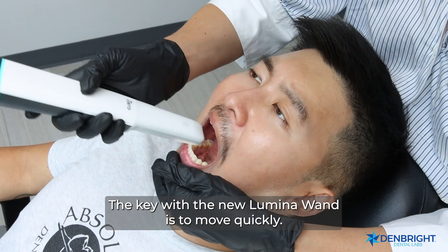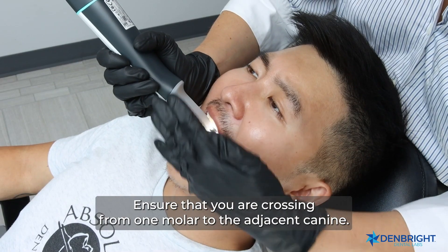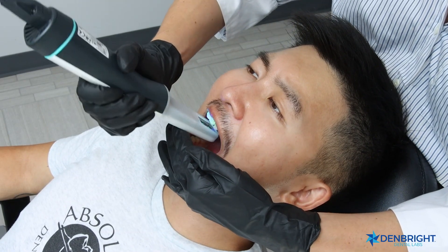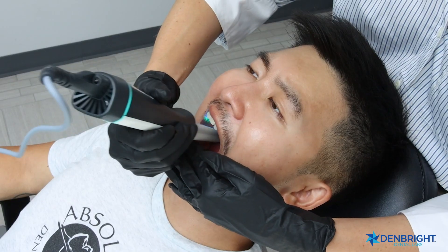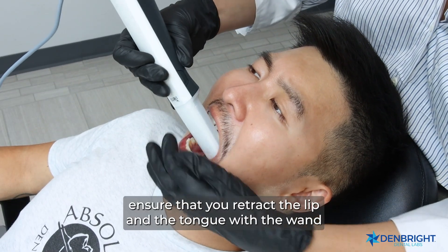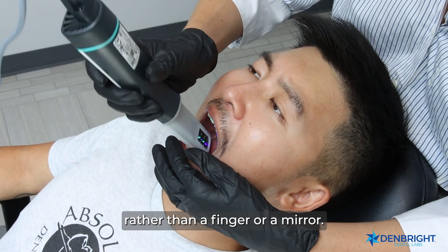The key with the new Lumina wand is to move quickly — we do not want to over-scan. For the top arch, ensure you are crossing from one molar to the adjacent canine. Using the wand tip, retract the lip and tongue with the wand itself rather than a finger or a mirror.